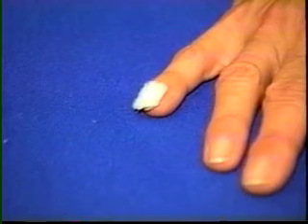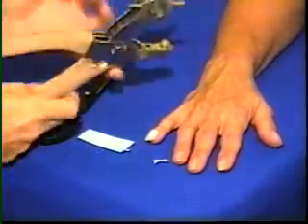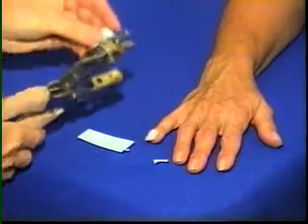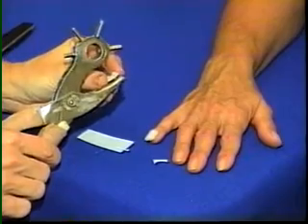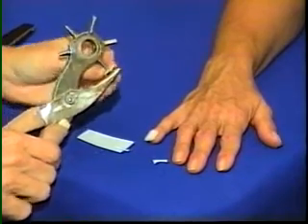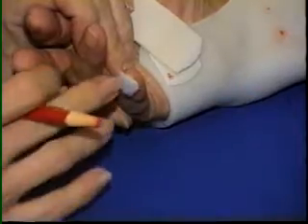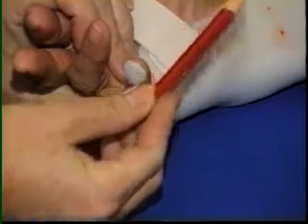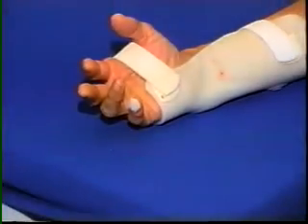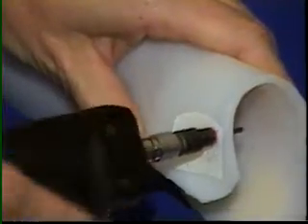Nail polish remover is used to remove the fuzzy velcro. A small piece of hook velcro is cut and a hole is punched in it. The location of the line guide is determined by the normal oblique angle of flexion. A hole is drilled in the thermoplastic, and the line guide is simply bolted into place.